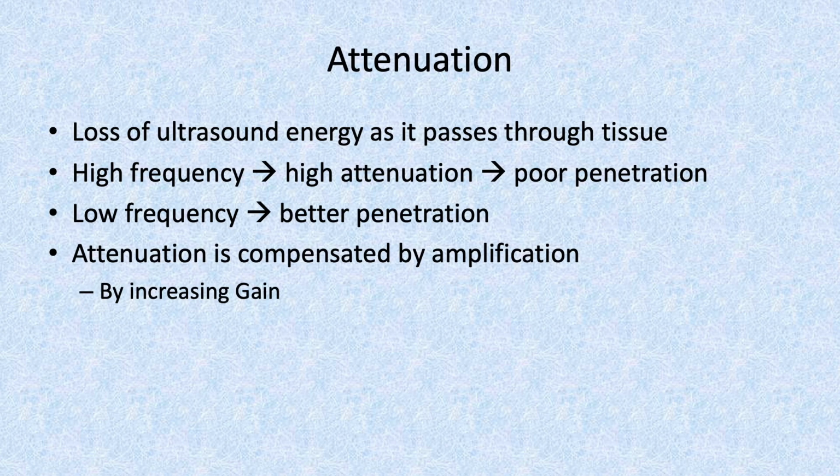If you are scanning abdominal structures or spine, you have to use a lower frequency probe to get better penetration. But the resolution is not that nice when you use a low frequency probe. So this is the thing: you sacrifice image quality for penetration.